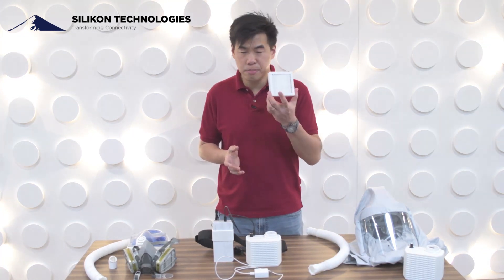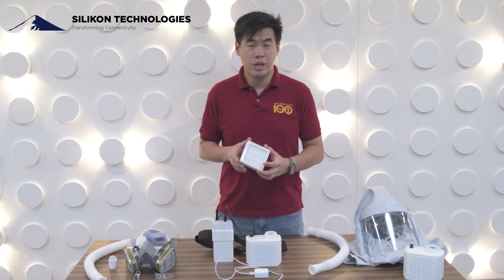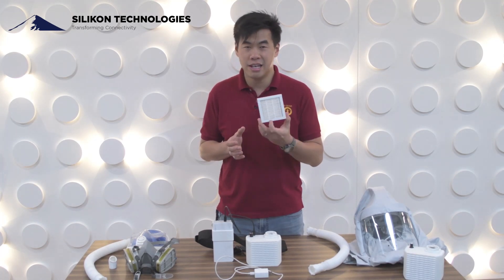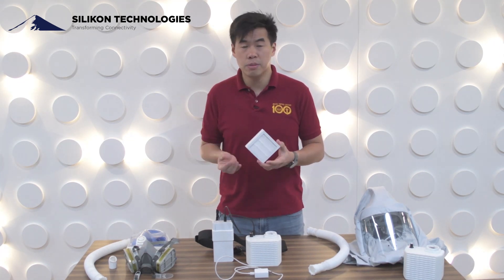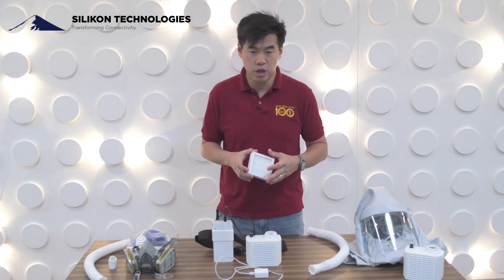The beauty of this HEPA filter is that it is locally manufactured and we have specific certification for it, so you are assured that it is of good quality. It's actually used for clean room semiconductor industries, so it can also be used for hospitals.